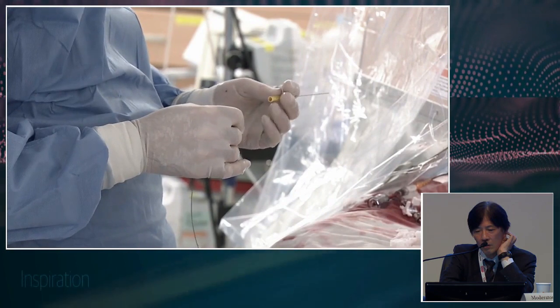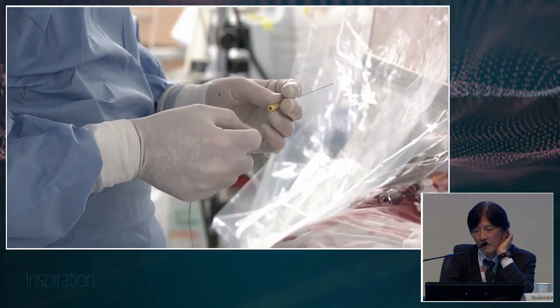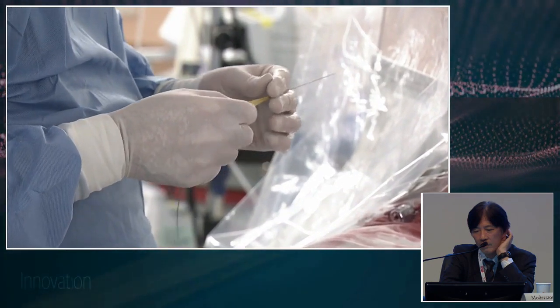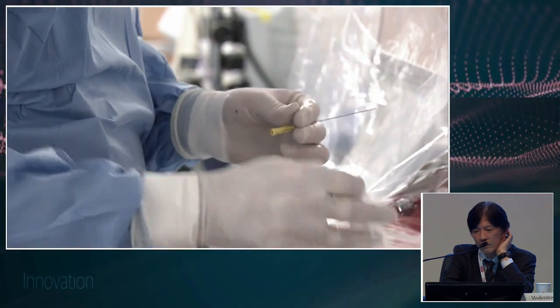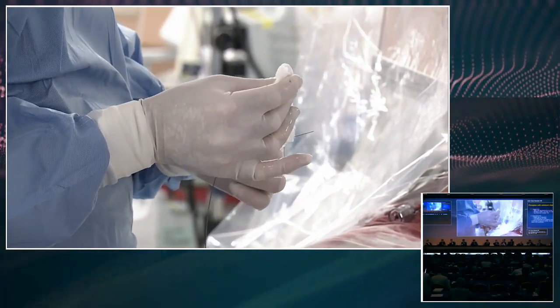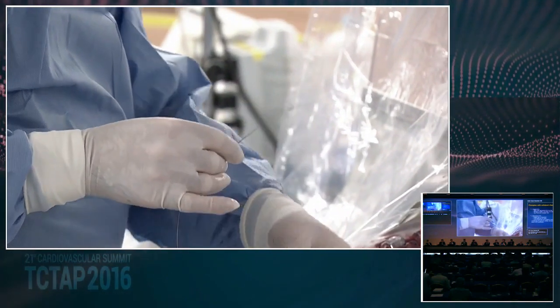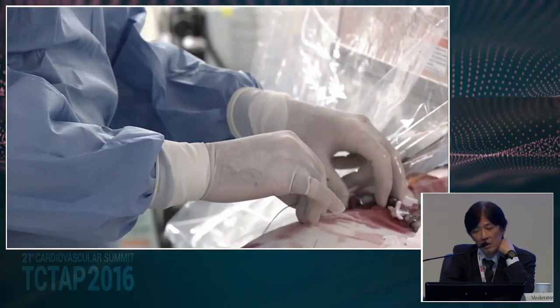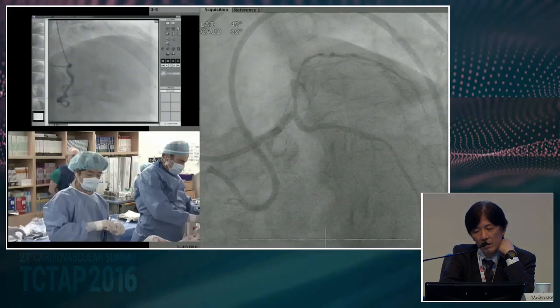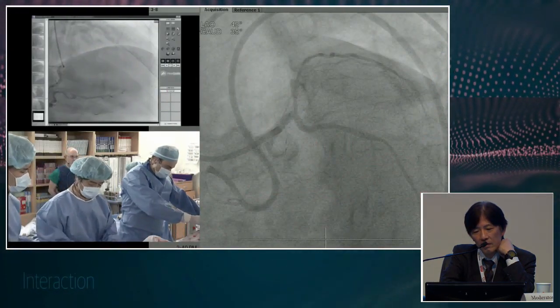And Dimitri, second one, how much time and radiation did you spend on that retrograde attempt? One gray. I don't have 7.5 frames, unfortunately. So that was one gray. Anyhow, so in this case, I think antegrade is a little bit more promising. Yeah, I'm going antegrade right now, and again, depending upon how that goes, all these are excellent suggestions.